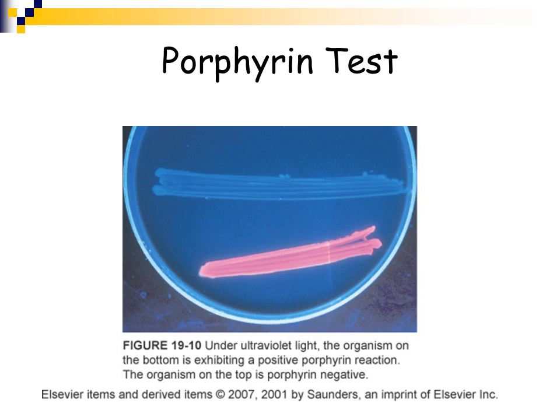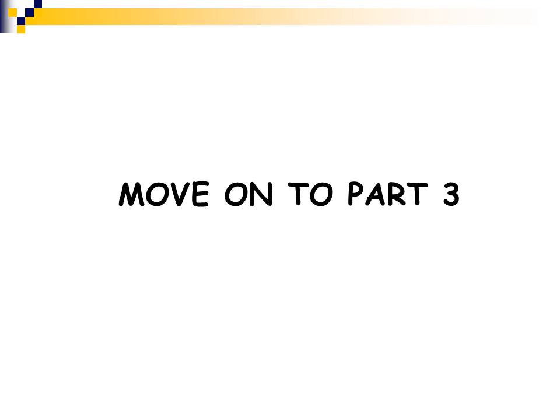I would say that most labs are either going to have a default of a quad plate, or more likely a default of a kit test such as the rapid NH test. So we're going to now move on to the third section of the fastidious gram-negative rod lecture.